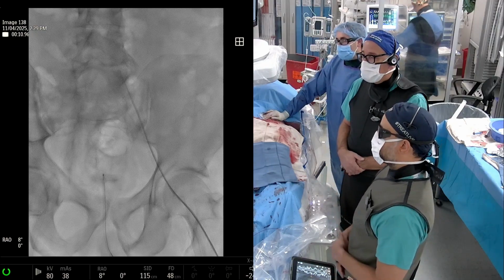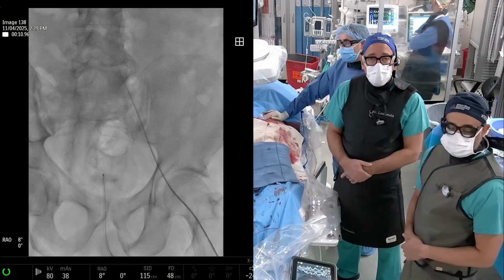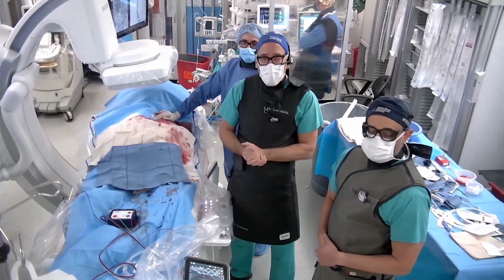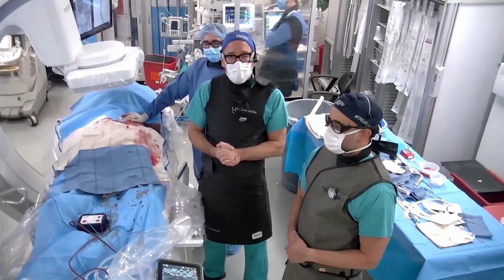So ultimately, we decided to just close with an Angio-Seal here, held pressure, and that's hopefully it. So great case result, great opportunity for multidisciplinary collaboration. The panel's input was incredible. Ultimately, we came up with a great result. I think the patient's going to benefit tremendously.